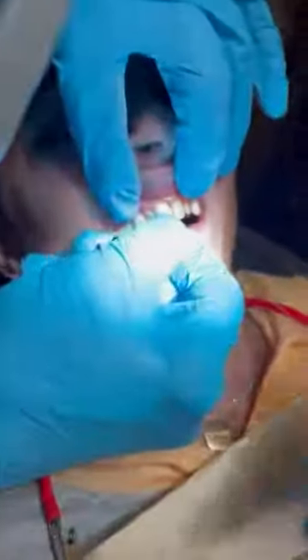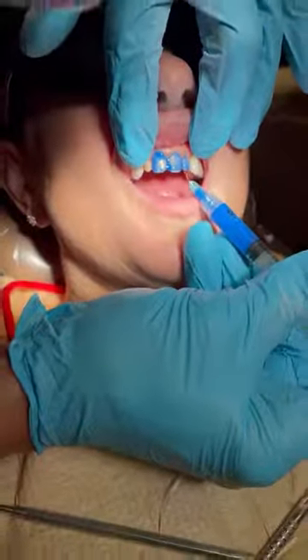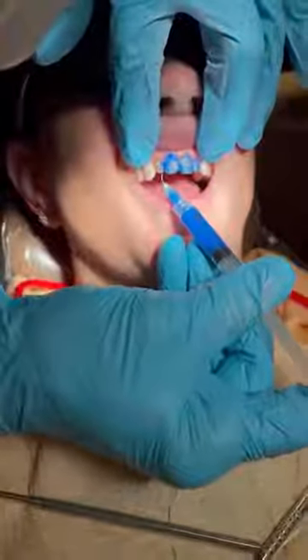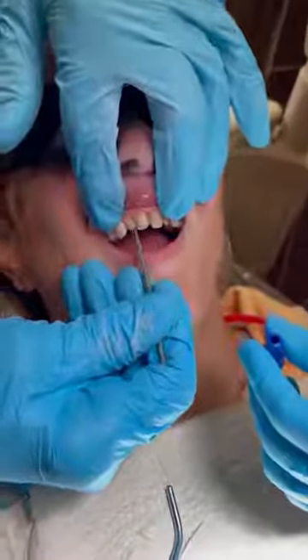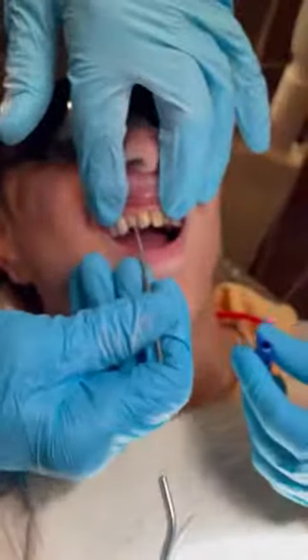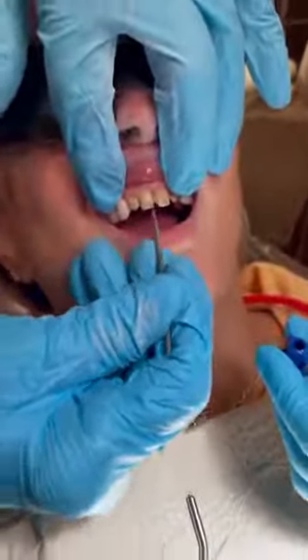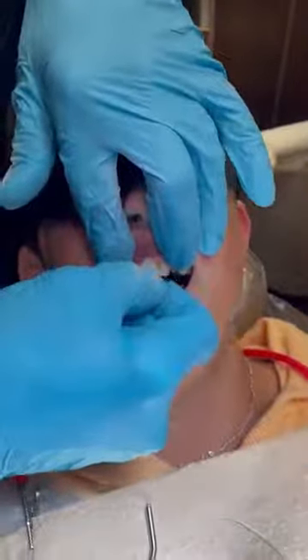And then we're going to mix up some glue and place them on her teeth. But first we're going to try them in just to make sure they fit and make sure that everything's perfect. And then we put a little degreaser on her teeth. That's what the blue gel is, and that cleans the teeth, it sterilizes the teeth, it etches the teeth, makes it easier or better for the glue to adhere to her natural teeth. Then we rinse all of that off, and we apply several of our bonding chemicals that help the crowns to stick to her teeth. And then we start putting all the crowns in.